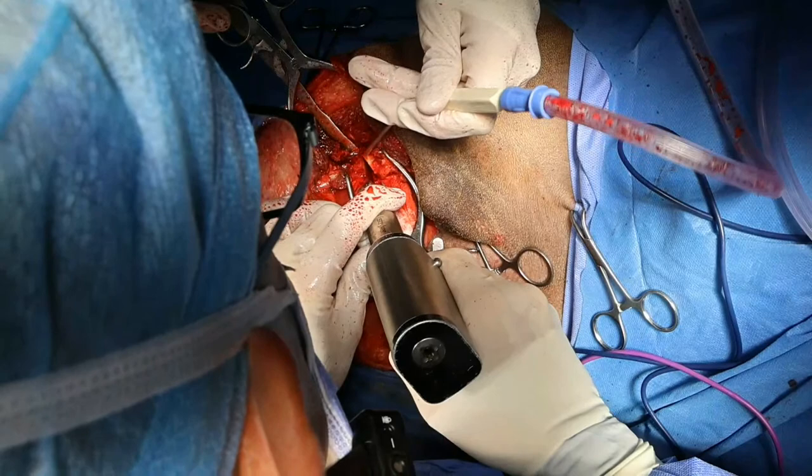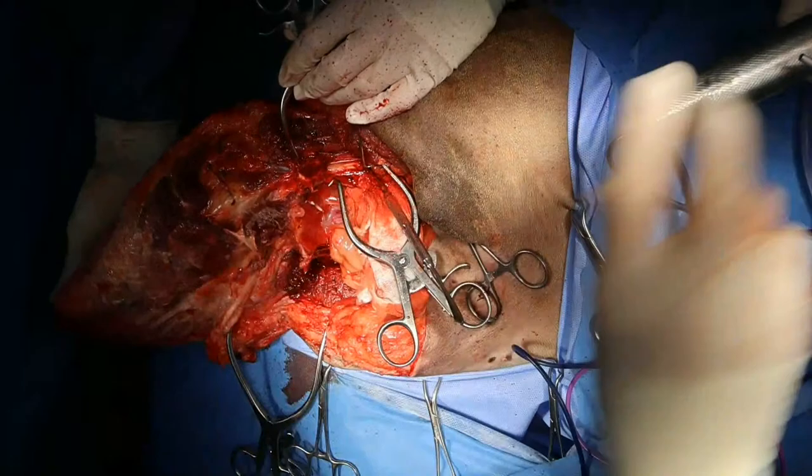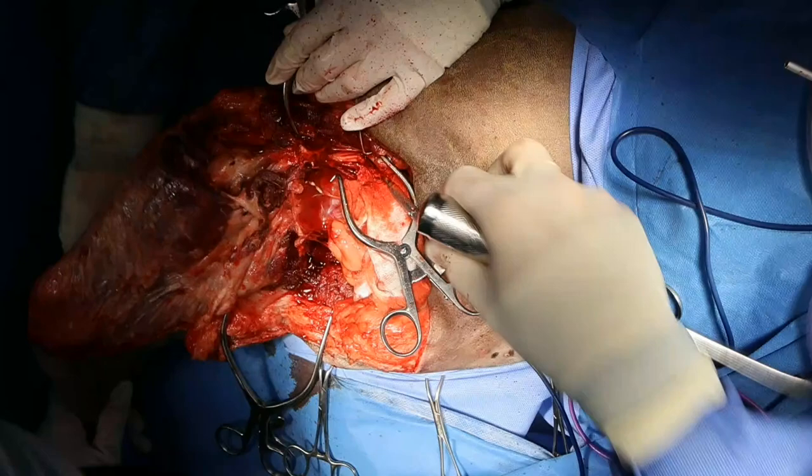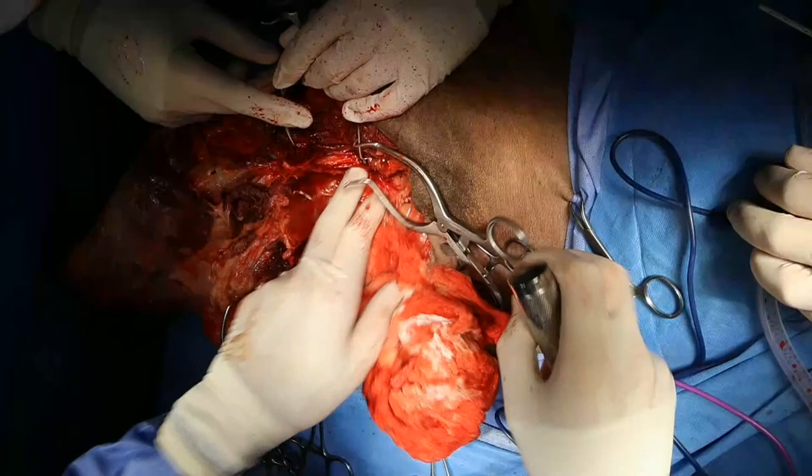And that's the sciatic nerve right there. Go ahead, you can let that fall. All right, so the sciatic nerve is sitting right there. And lo and behold, we're looking at colon here, and urinary bladder and urethra and all that good stuff.